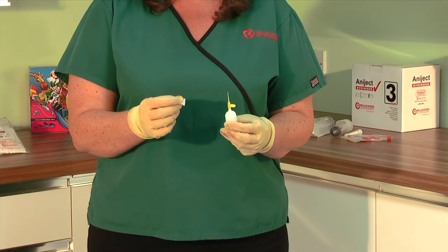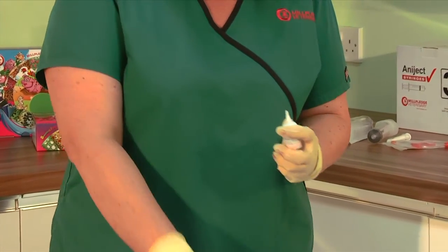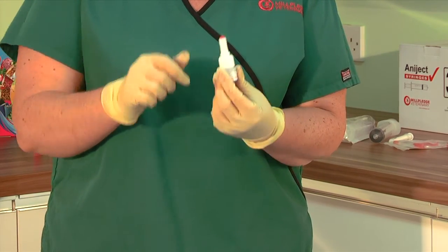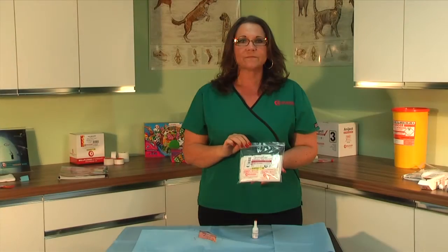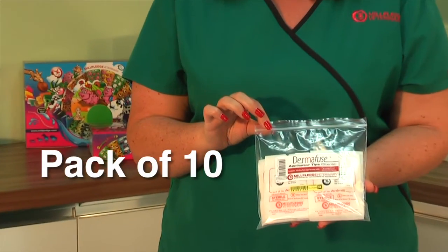When you've completely finished your procedure, you will remove your applicator tip and replace it with your cap with the built-in spike. Your Dermafuse is now ready for the next time you need to use it. If required, we also provide extra applicator tips in packs of 10.